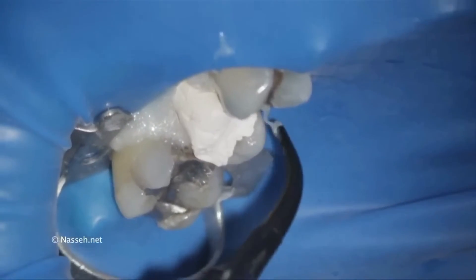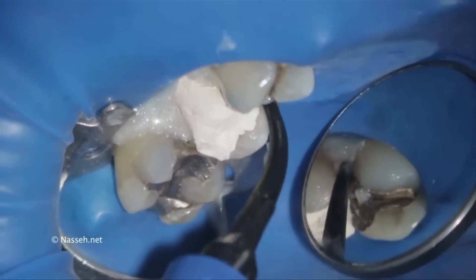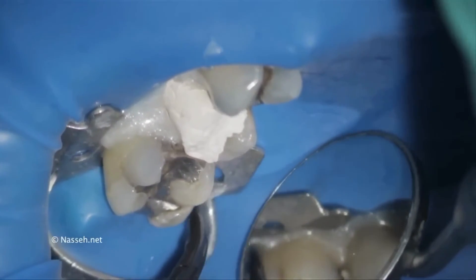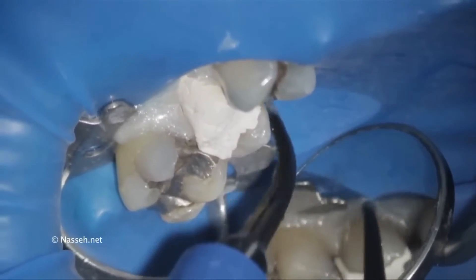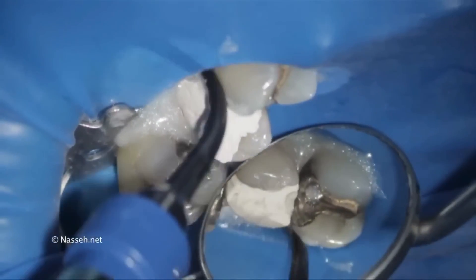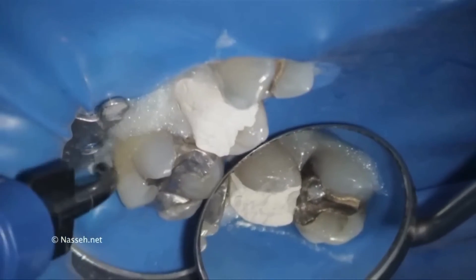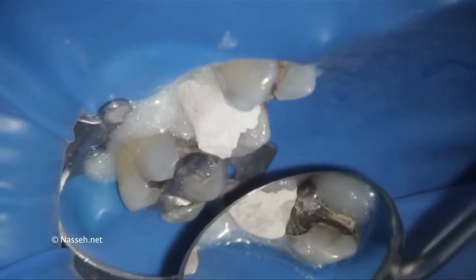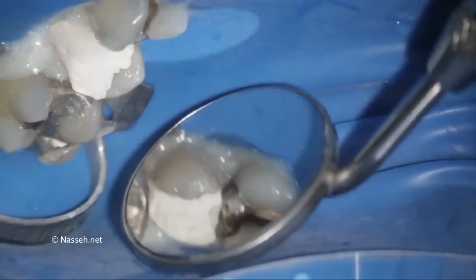Opal Dam is also used during bleaching in the anterior area to isolate the gums and keep them away from hydrogen peroxide. In this application, it seals the exposed gingiva and areas around the rubber dam. However, potential leakage of saliva and air from the patient's breath is still possible.